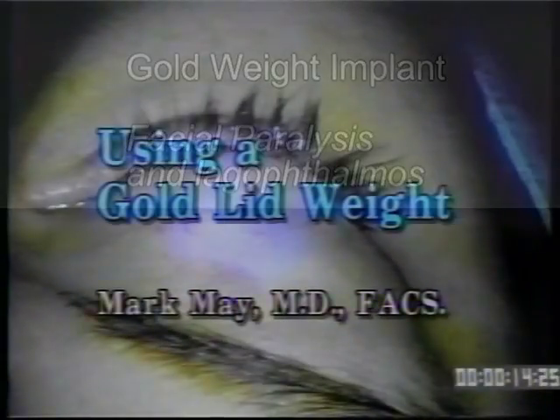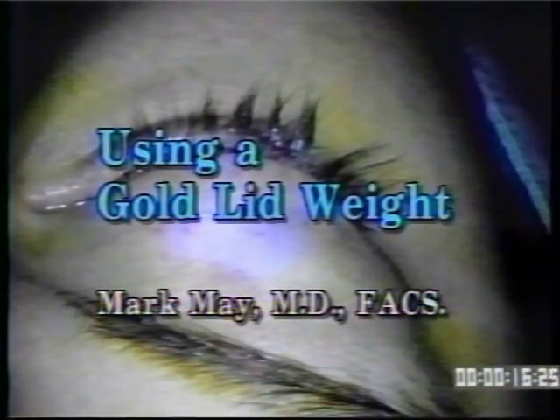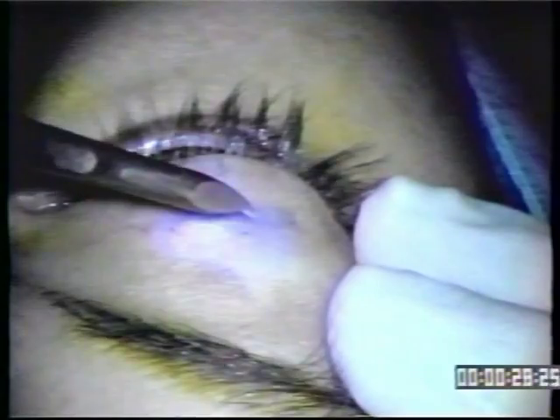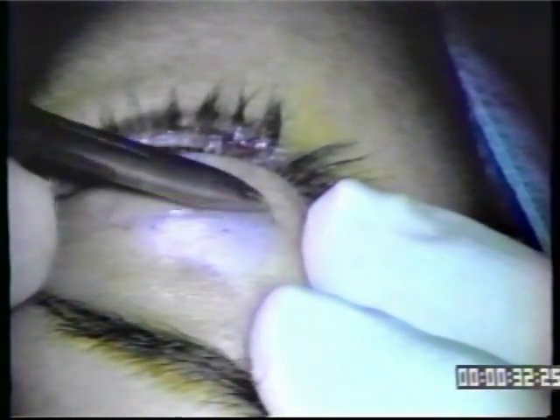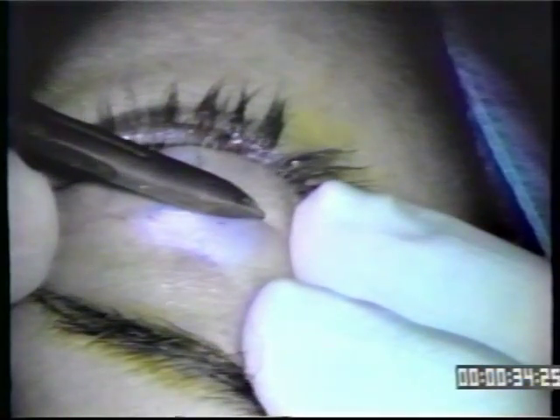The Gold Lid Weight is a very useful technique for re-establishing eyelid closure. Incisions are made in the natural skin crease in the supratarsal fold, and a mark is made right at the mid-pupil line. The incision is made after the area is infiltrated with 1% xylocaine and 1:100,000 adrenaline. We wait about 5-10 minutes for hemostasis.